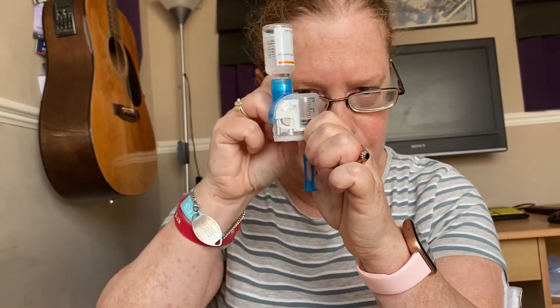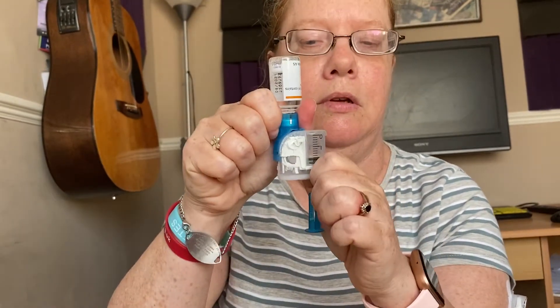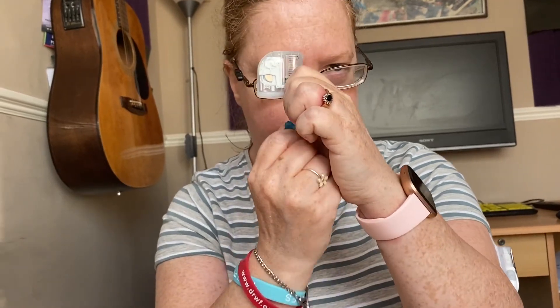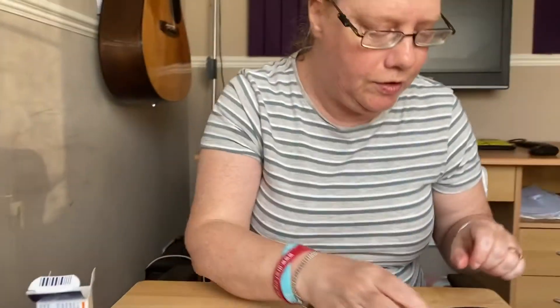I'm just going to flick the air bubbles away so there are no more air bubbles. I take that off and set it aside, because I'll be putting it into the new pump base. The reservoir is all done and ready.